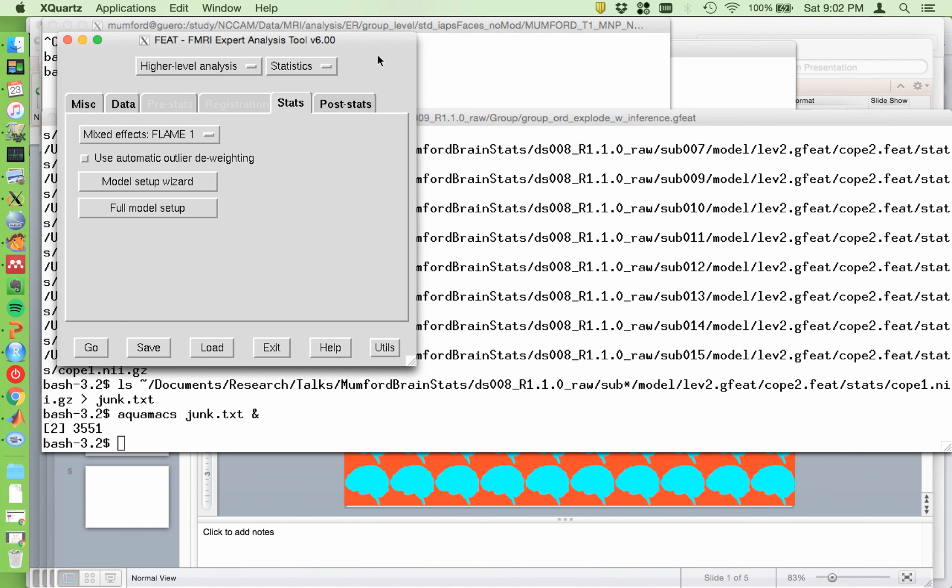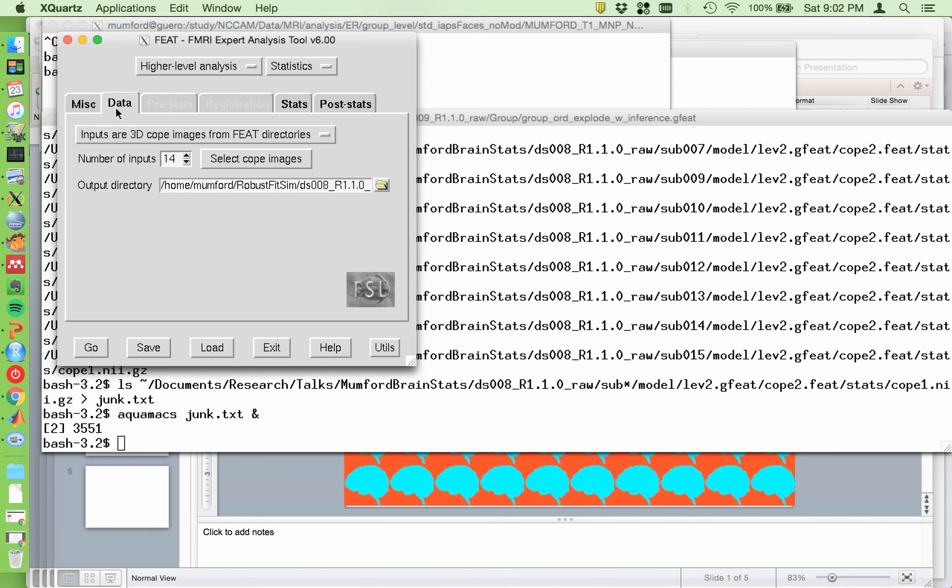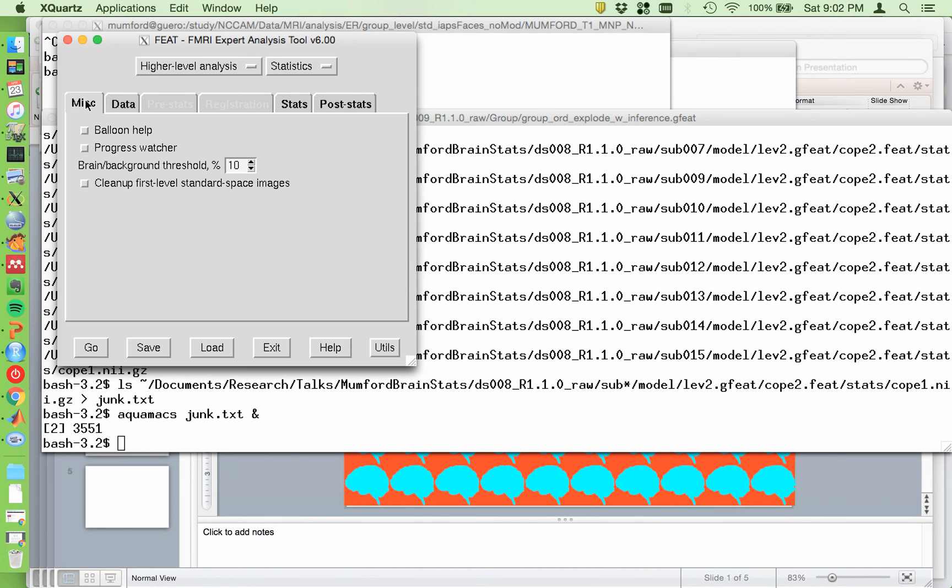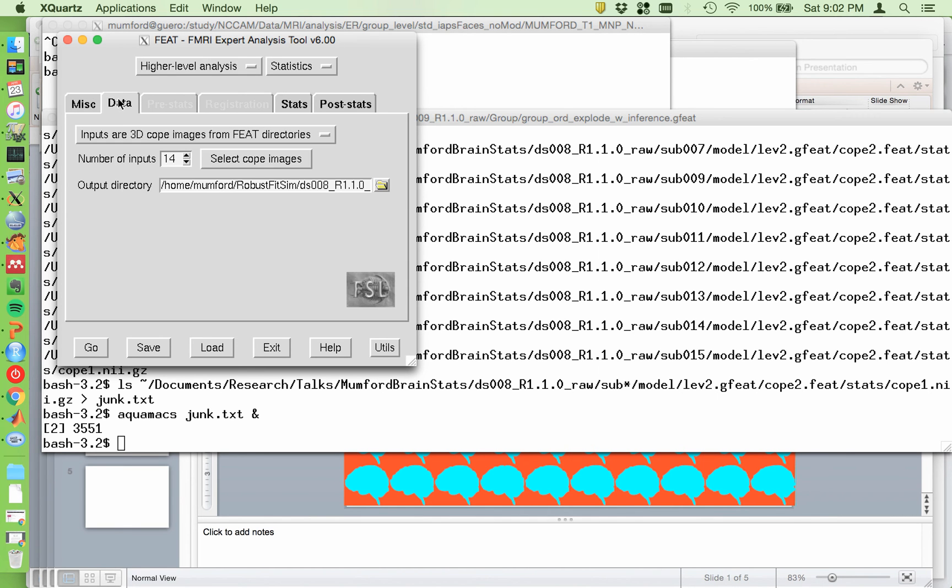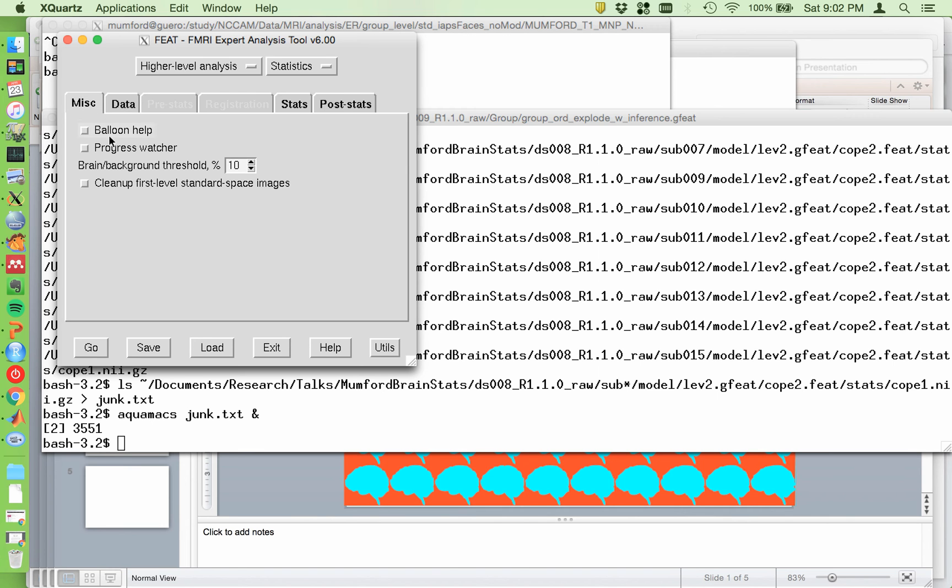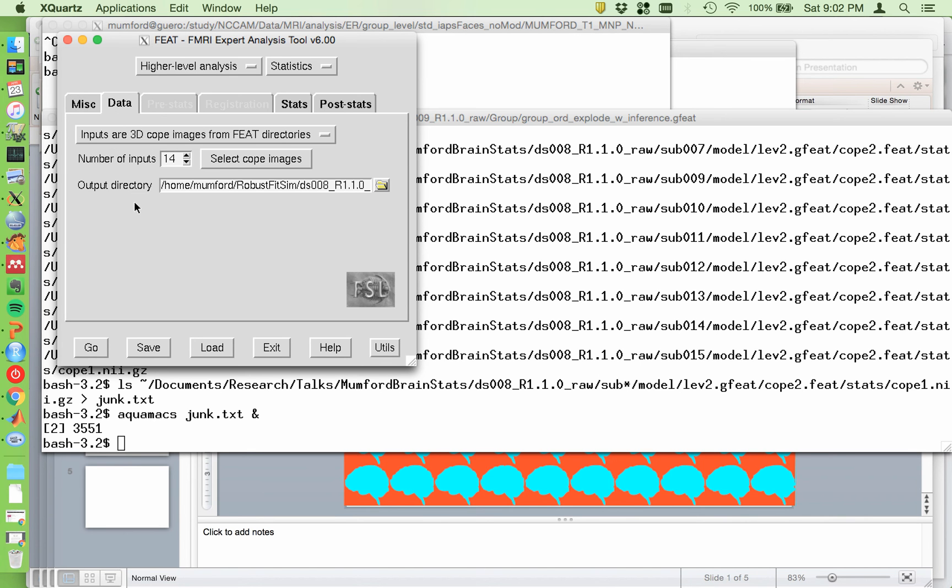Alright, so here's the GUI. Actually, I already filled it all in. We've already been through this. In the MISC tab, I usually turn off the Balloon Help and the Progress Watcher. You can turn it on if you want, but I usually have it off.